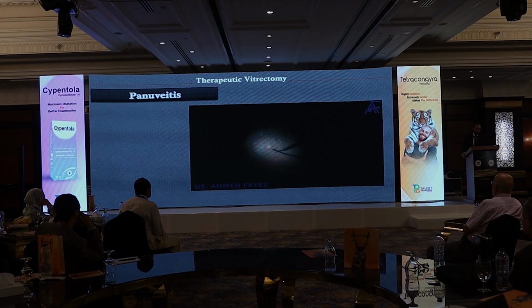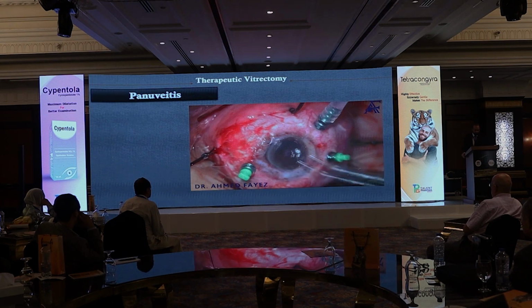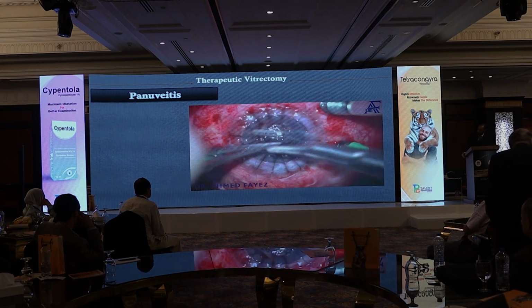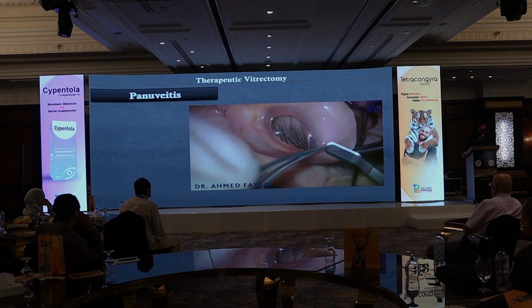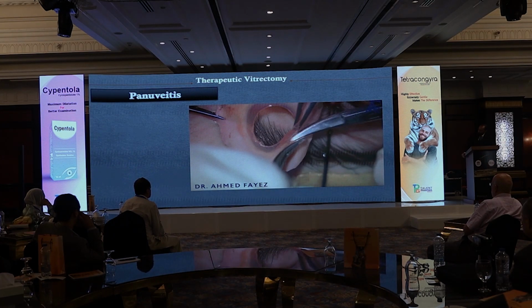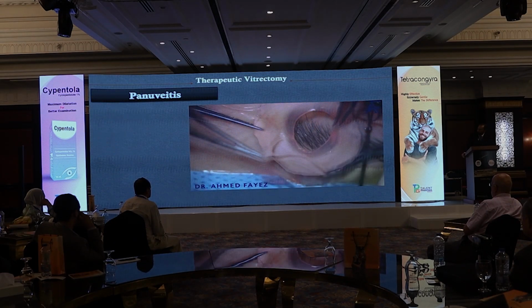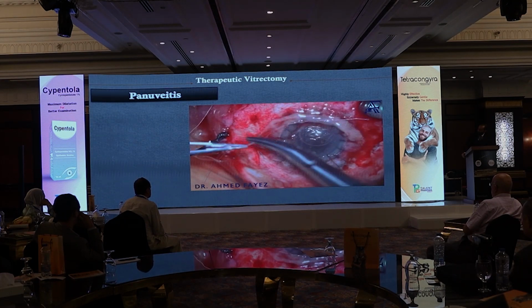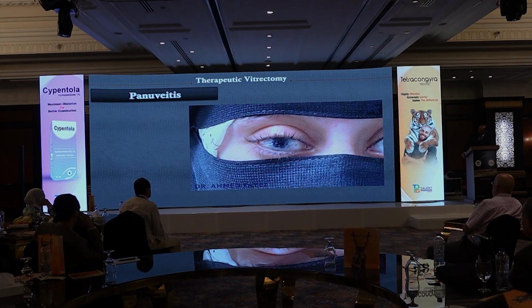We did laser for the weak parts that you can see, and then we did keratoplasty. Unfortunately, the patient had a stem cell deficiency, so my dear colleague, Dr. Hisham Gharib, decided we would implant stem cells. The patient refused to take it from the other eye, so we took it from the graft itself, and we implanted these stem cells here. The patient is seeing 6/60 right now.